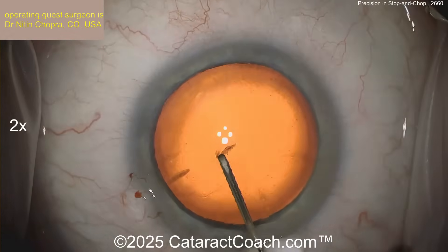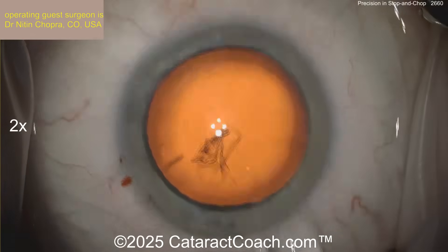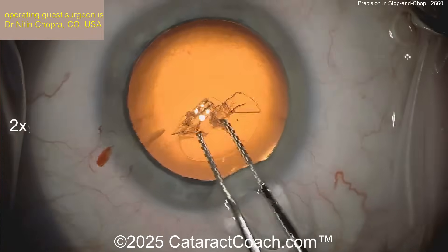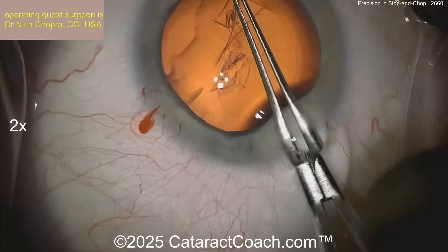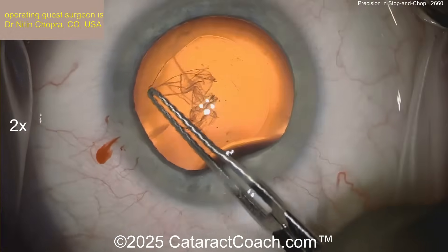You've got to really find your passion, and we're so lucky that our passion is ophthalmology. Starting off here, it looks like a pretty routine kind of case. Nice red reflex there. Here comes the rhexis — nice technique there. It looks like a right-handed surgeon. We've got a nice little paracentesis about three o'clock hours away, going to be for the second instrument. Here comes a nice-looking rhexis, and completed.